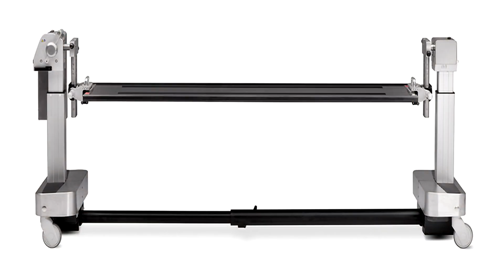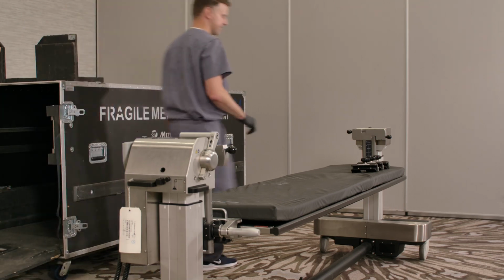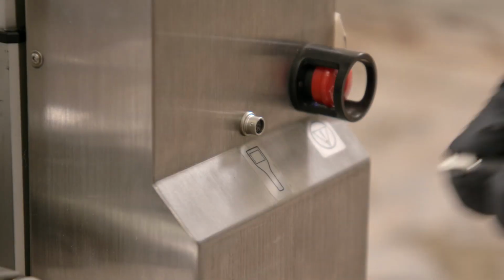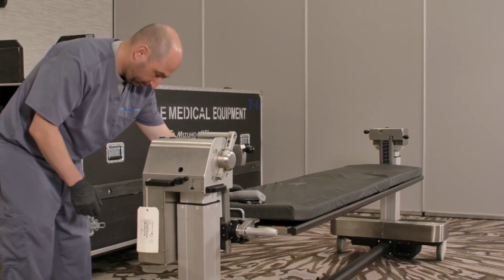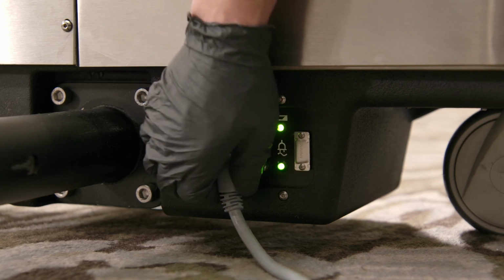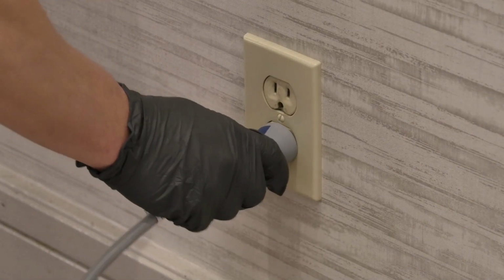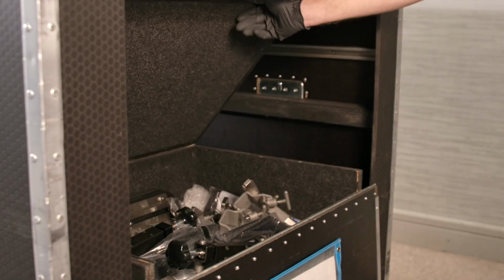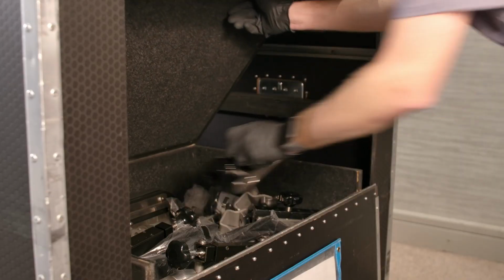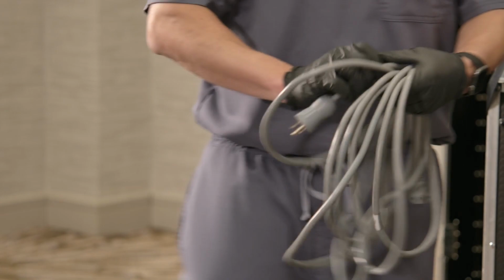When the lab is over, the table is ready to break down. Head to the back of the crate and open the back door. Unplug the hand pendant and then turn off the power to the Trios table. Unplug the power cable to the Trios at the bottom of the table and the wall plug. Then coil up the cord. Place the accessories into the back of the crate.